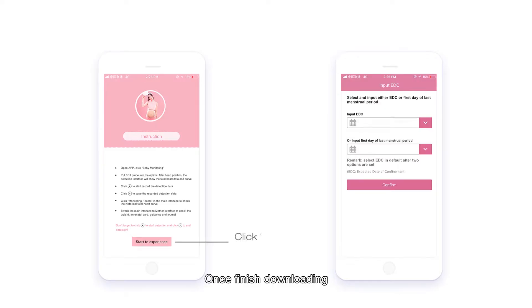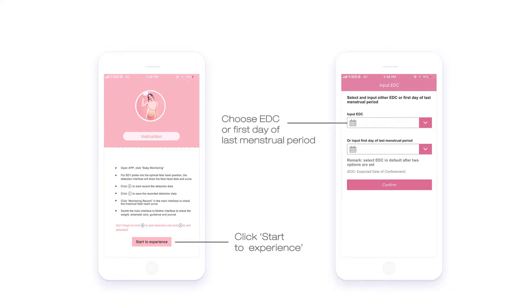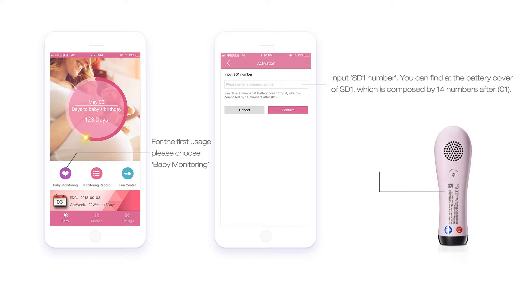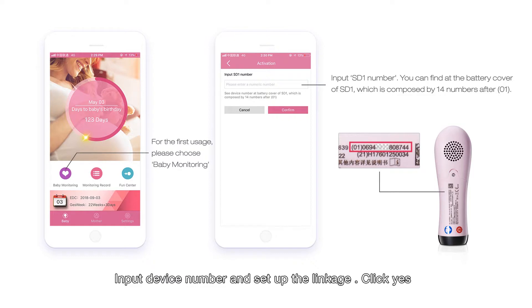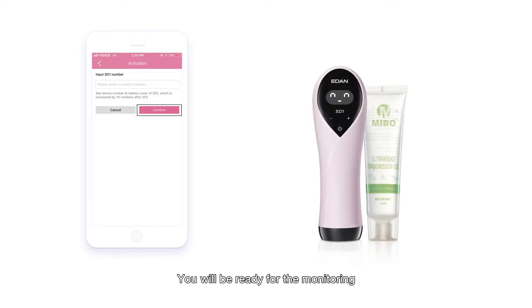Once finished downloading, open the interface and start to enter your last period date or your estimated gestation time. For the first-time user, click Baby Monitoring to enter the activation page. Input the device number and set up the linkage, then click Yes. Now you are successfully connected to your device and ready for monitoring.